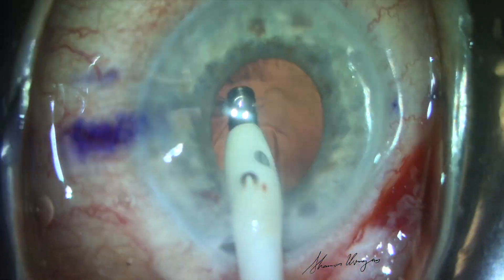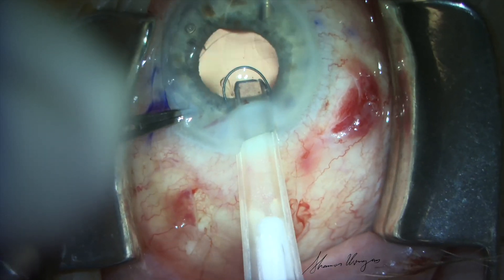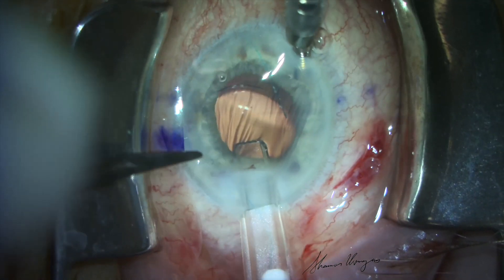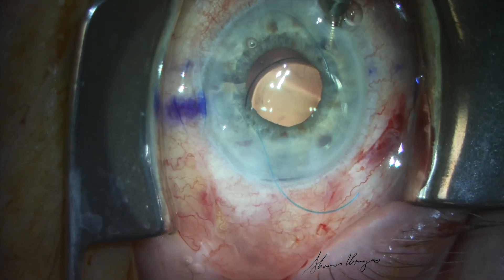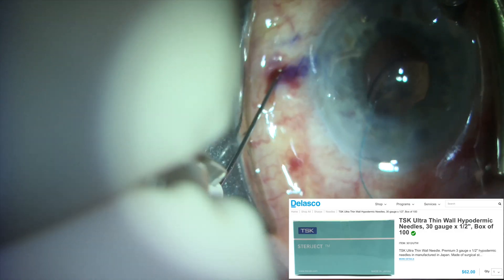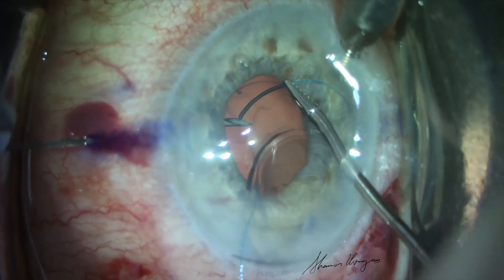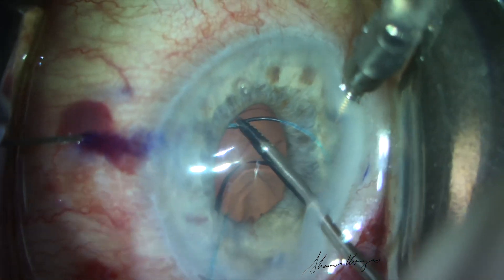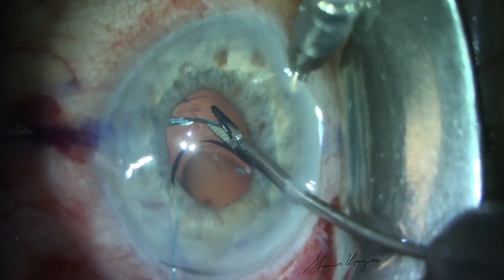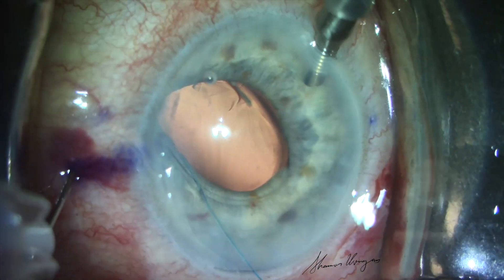Anterior vitrectomy is again performed. An anterior chamber maintainer is then introduced. A Bausch & Lomb LI-61 three-piece aspheric lens is placed into the anterior chamber. Then endicoat is used to protect the corneal endothelium. The thin-walled 30-gauge needle is used to enter the eye 2.0 millimeters posterior to the limbus. We then grasp and place the leading haptic into the needle tip. It is important to slide enough of the haptic into the needle so the haptic remains secure once we leave it while we work with the needle on the opposite side.